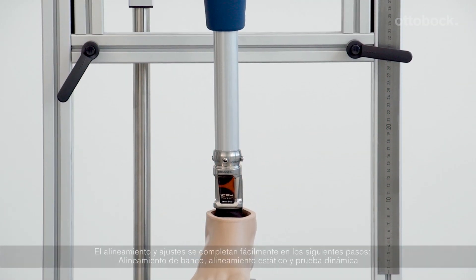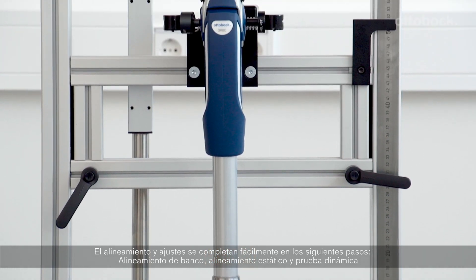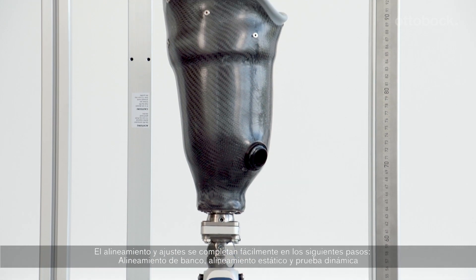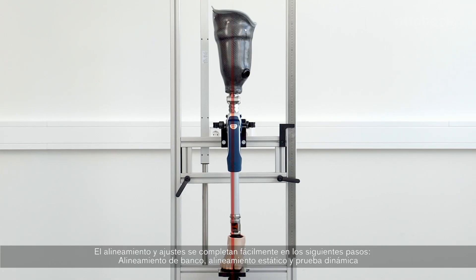The alignment and adjustments are easily completed in the following steps: bench alignment, static alignment, and dynamic trial fitting.